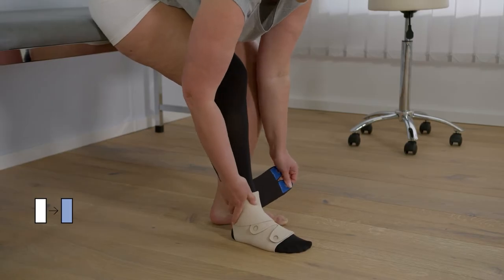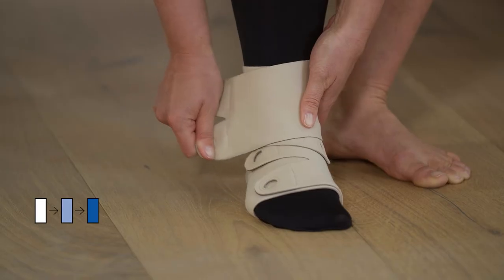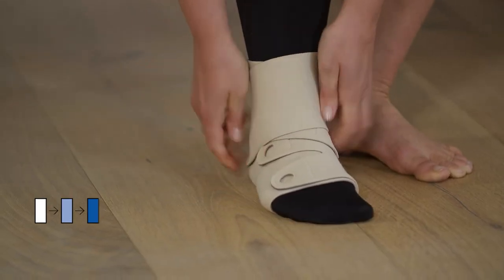Pull the ankle strap with the two pronged dark blue fastener at full stretch across the front of your foot and fasten to the opposite side at a downward angle or aligned with the strap below.